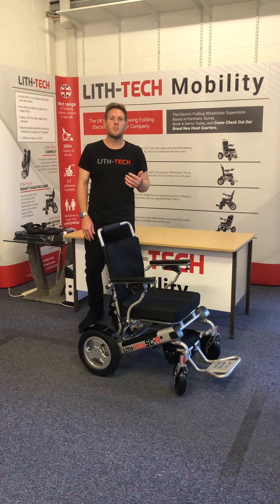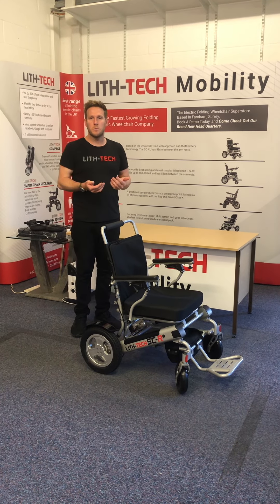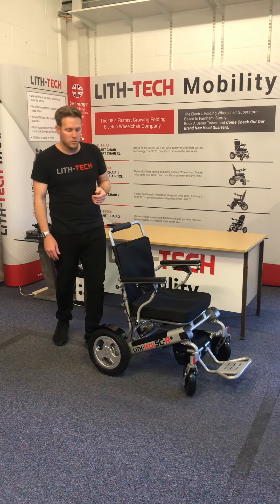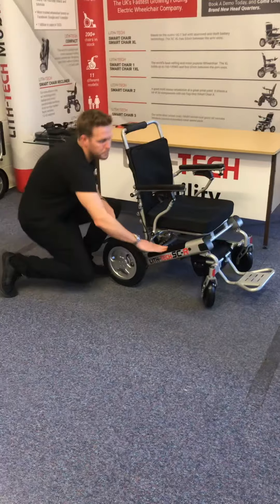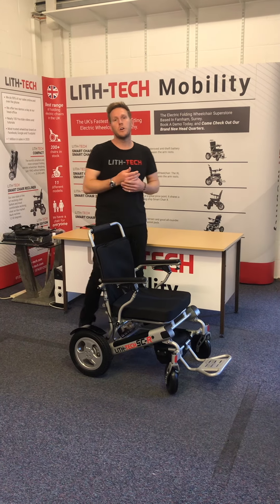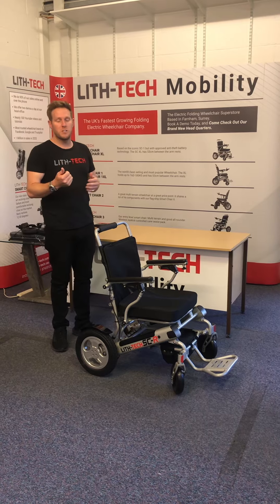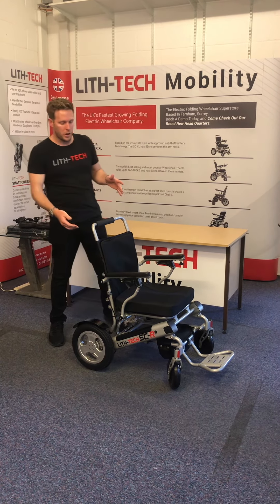It's got a few more advantages: a slightly lower foot plate, smaller folding dimensions, it's a touch lighter, and it's got a new battery style — your battery slots down inside the frame. This chair is actually a kind of adaptation or modification of our Smart Chair range. Currently we've got the Smart Chair and the Smart Chair XL, and now this one adds to the perfect trio making it the Smart Chair Recliner.